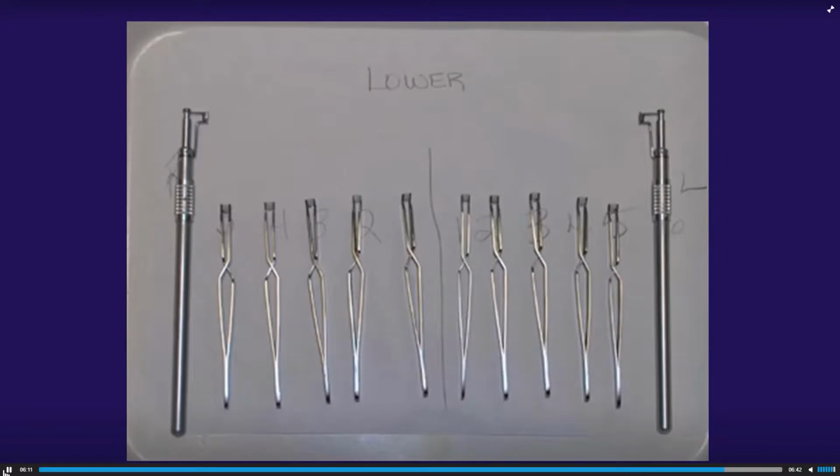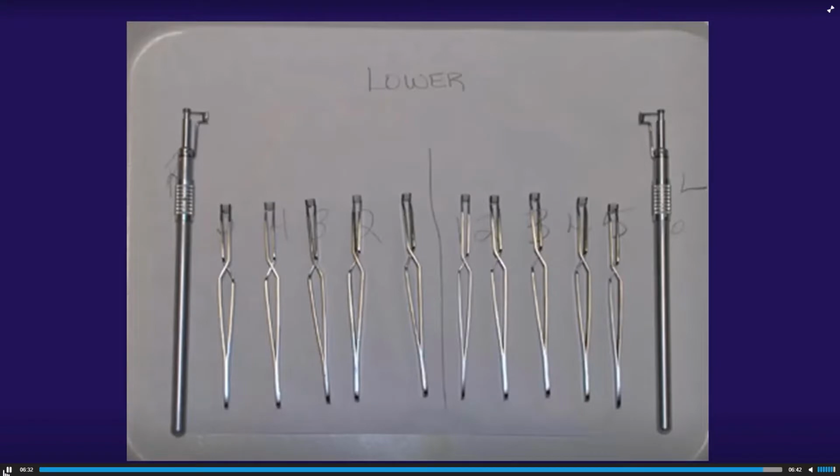And if you're going to be doing a lot of direct bonding, like a whole arch or a whole mouth, okay, make sure to get enough of these reverse action bracket holders, okay? You want them all locked and loaded. You don't want just one where you're picking a bracket out of the package, then fishing out the next one. Get a whole bunch. They're not very expensive. Get as many as you need. The ones on the ends are actually reverse action molar tube holders as well, okay? So those are really cool. You're going to want to have some of those too.